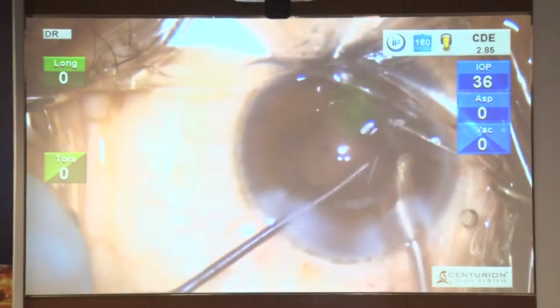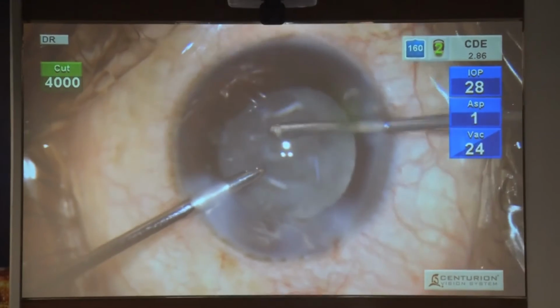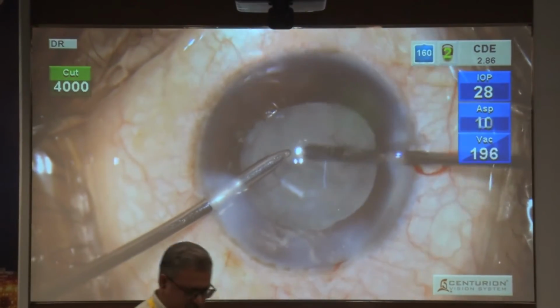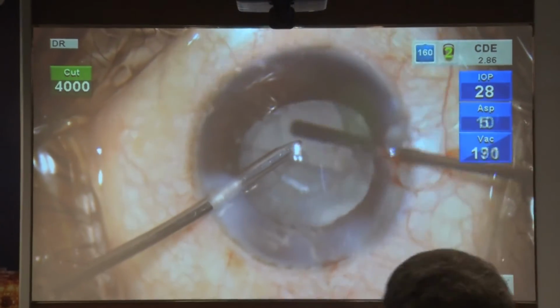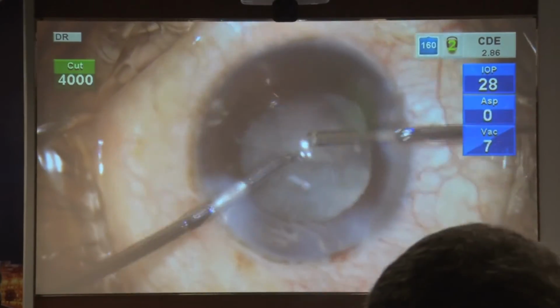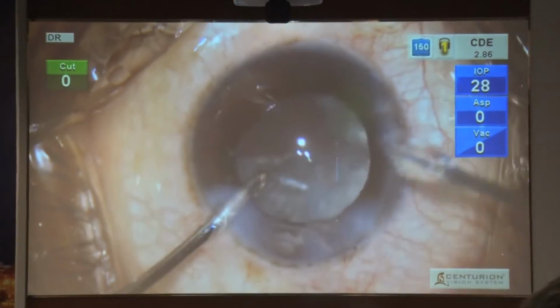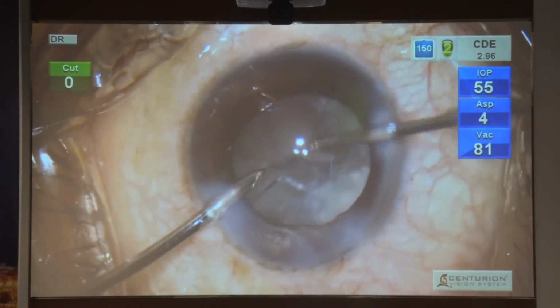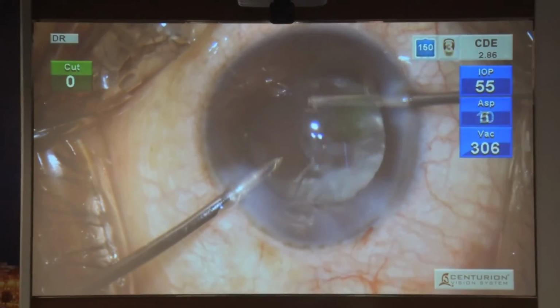This is something which I got adventurous with after seeing Osher's video, which said that the vitreous is a scaffold, and if the vitreous is formed, it's not going to allow the nucleus to drop down unless you churn it. And you churn it only by having higher fluidics. So the most important thing out here is to decrease your fluid that's going in and out. Drop down your flow rates, drop down your bottle height, drop down your vacuum.